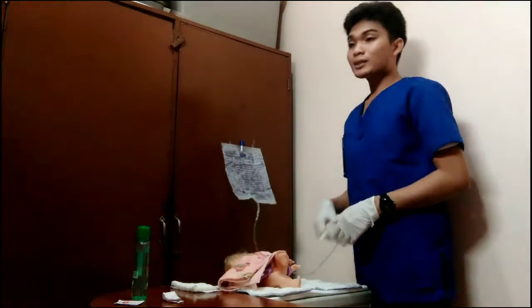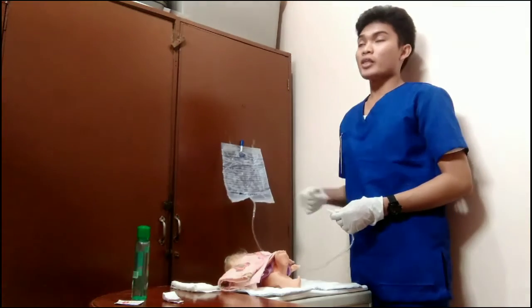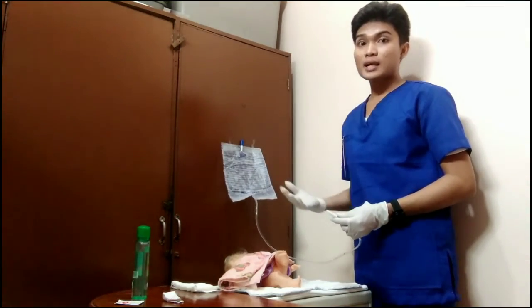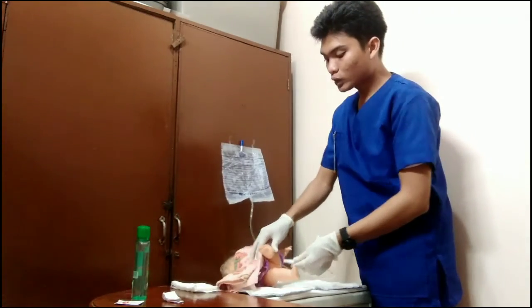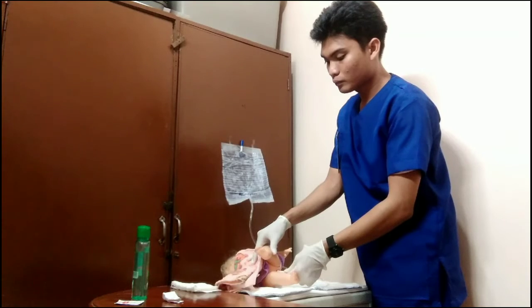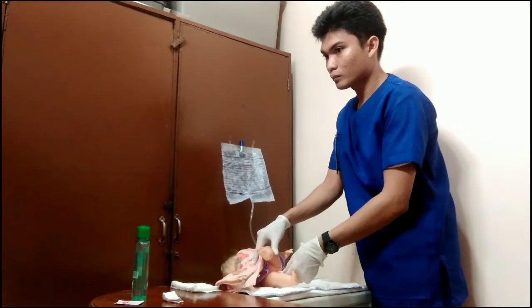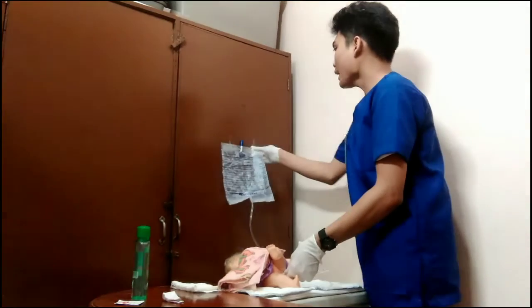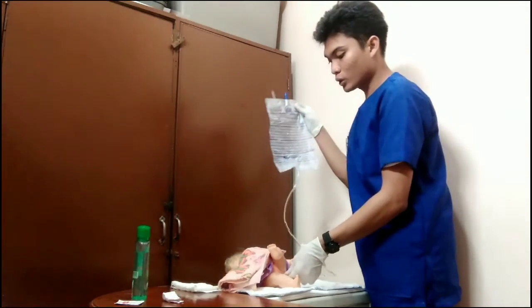Now, let us assume that there is no resistance with the patient. We will now be inserting it at 7 to 10 centimeters. We will be opening the clamp and raising the solution container.